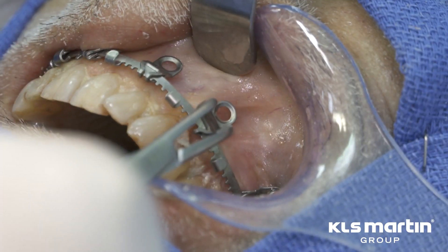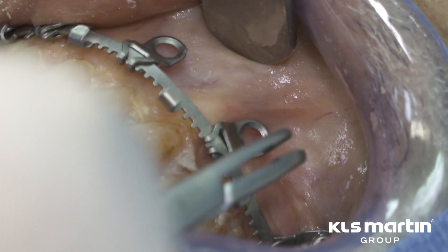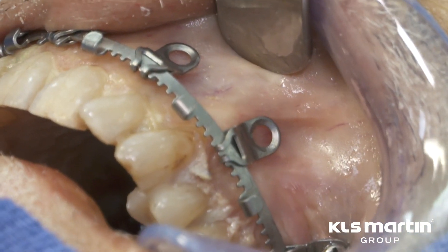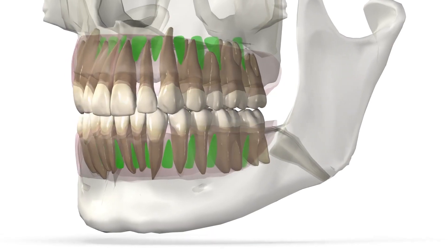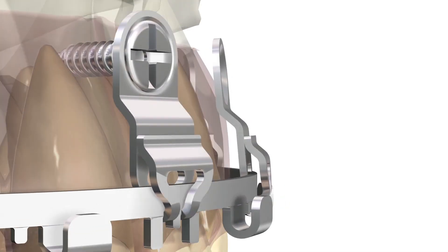The primary challenge of a bone-borne MMF solution is the avoidance of tooth roots. The L1 MMF design allows the surgeon to easily avoid tooth roots with a unique plate design. Sliding bone fixation plates may be positioned on multiple locking teeth along an arch bar either by hand or with the aid of plate forceps.